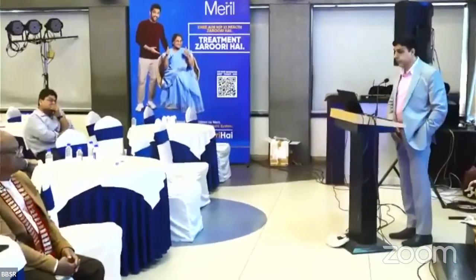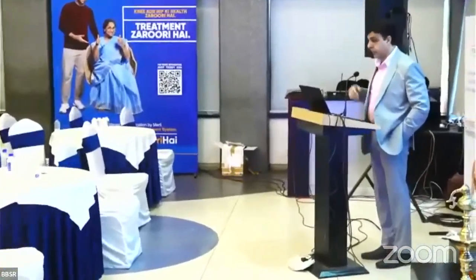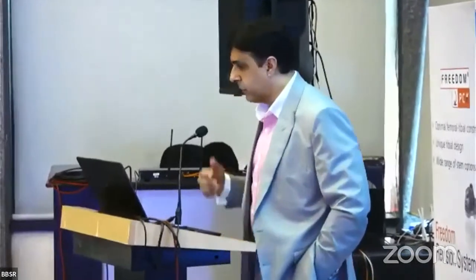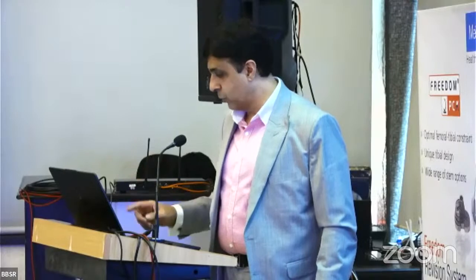Third case, a 58-year-old female, index surgery for primary bilateral knees. I did her bilateral. It was the time of the launch of Attune knees at that stage. I did an Attune bilateral TKR on her and she was doing fabulous. She was doing absolutely fine till around a couple of years. But then she presented to me with this picture. I was very surprised to have this kind of presentation of heterotopic bone, because if you look at the past, there was nothing. She presents to me 2 to 3 years later with this kind of picture.